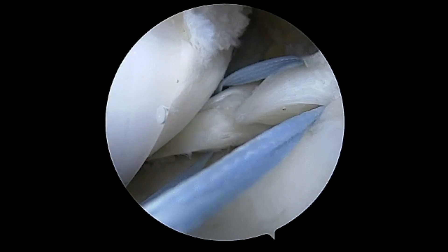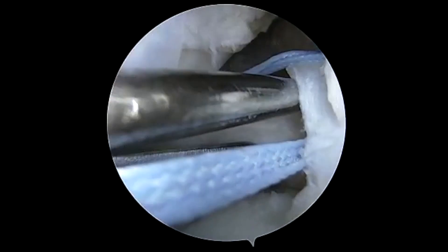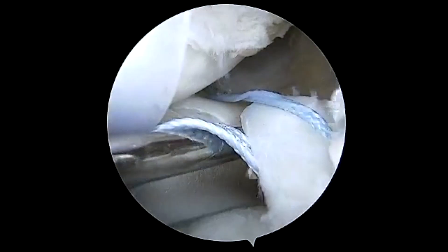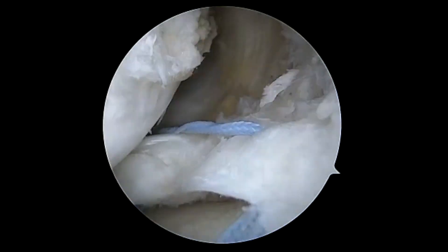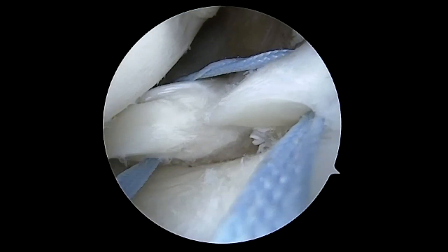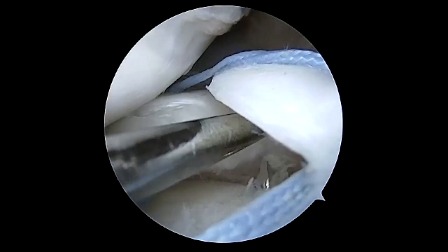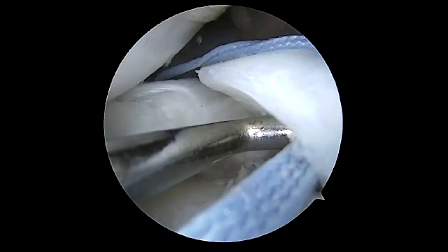We'll grab the top limb and use the passer upside down to pass this in a horizontal mattress fashion. We have the two limbs inferiorly that will be dunked into a tunnel, which has shown the highest biomechanical strength. Here we're using a Smith & Nephew root guide to drill our tunnels, keeping our entry at the lateral portion of the tibial tubercle to avoid intersecting the ACL tunnel.